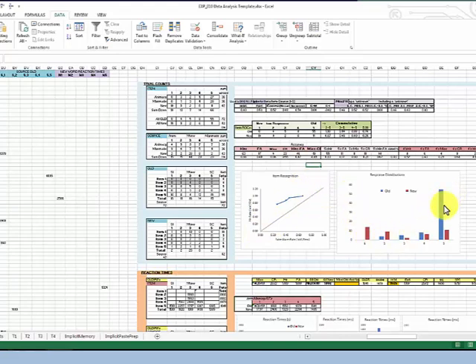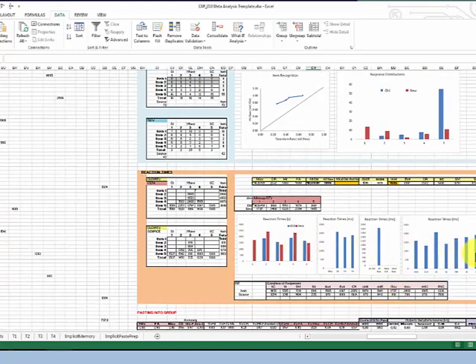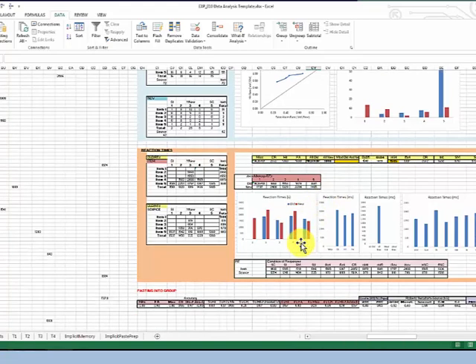We can quantify the distribution of the responses for old items on the old scale or new items on the new scale. Those will be the main metrics you'll show them, probably your percentage of hits, false alarms, perhaps their ROC performance, or their distribution of responses there. So that's the main thing. We look at reaction times down here in this orange shaded background, and those will self-populate too for the most part. So you can show them if they're responding differentially. And that's kind of the idea.